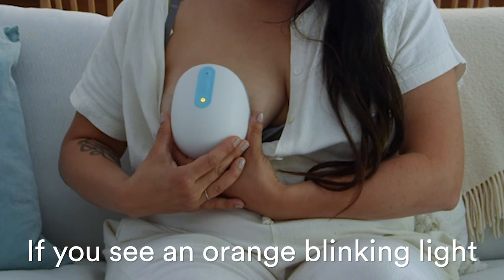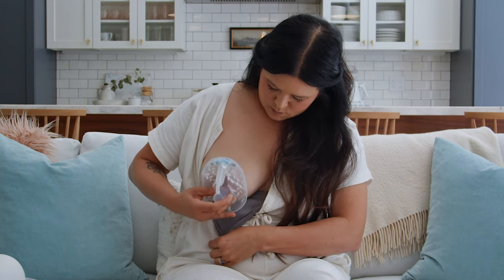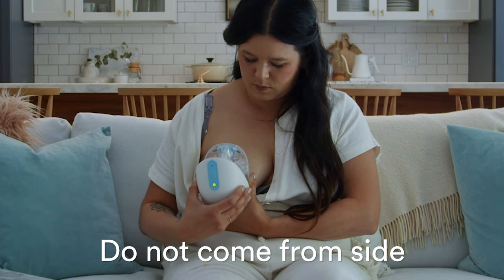If you see an orange blinking light, take the pump off and start over with just the flange or container again. The error may have happened because the pump was attached at an angle. Avoid bringing the pump from the side or bottom.